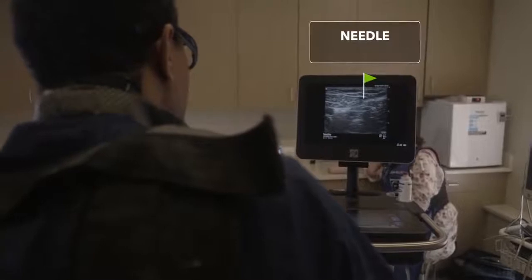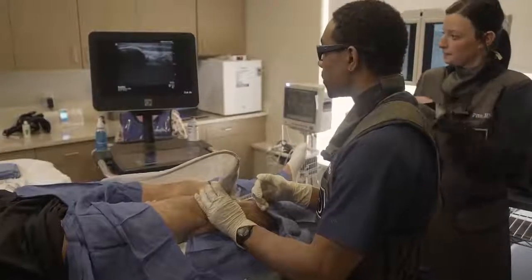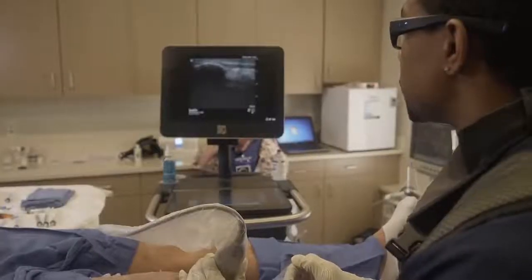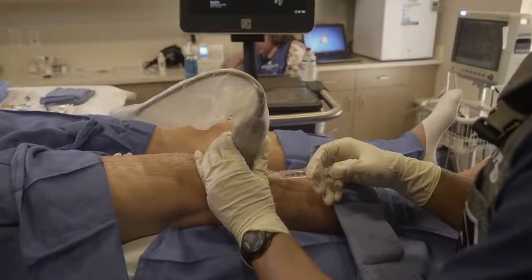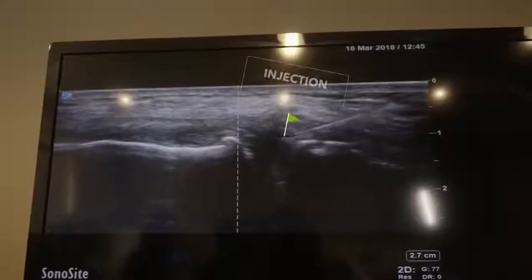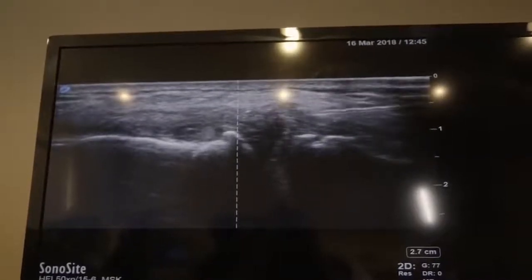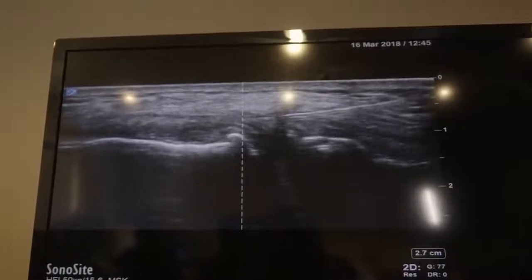We're going to start off with a little nerve block. We've got the needle coming in from the right for this nerve block. Since we're injecting closely and putting the cells in, we're going to use ropivacaine, which we know is not toxic to stem cells. We cannot use marcaine or lidocaine at all. Now connecting the coronary ligament and the MCL right around it, then redirecting to get the higher-up part of that MCL.